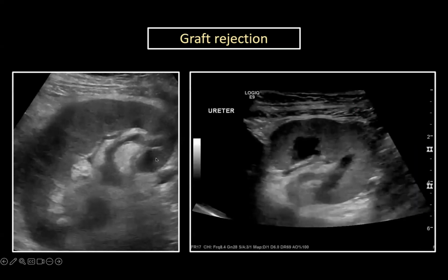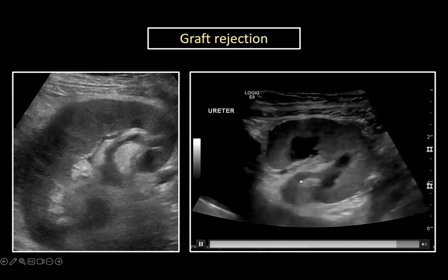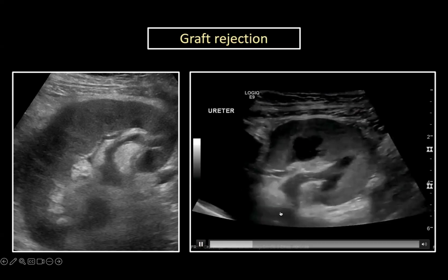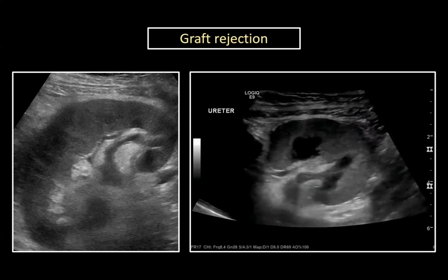has rejection. And sometimes this urothelial thickening can be mistaken as hydronephrosis, but here you can actually see that there's thickening of the urothelium here. Here's another case here on a cine clip where you can see the ureter coming out right here is actually markedly thickened. So when you see a markedly thickened ureter, think to raise the question of whether the patient has rejection.